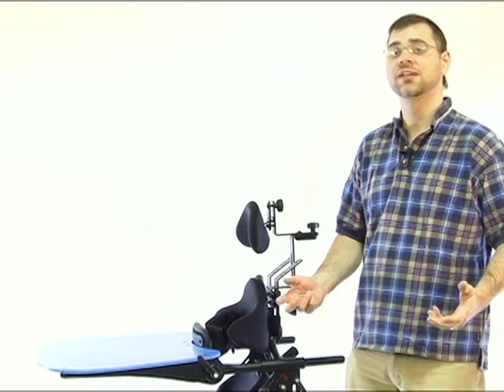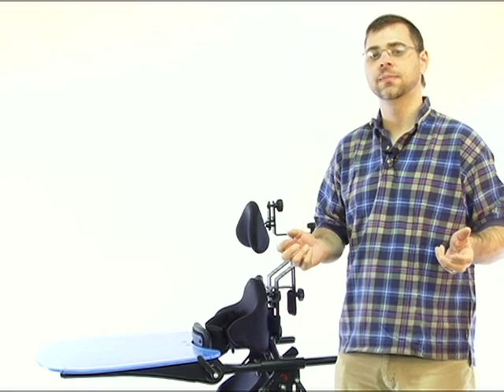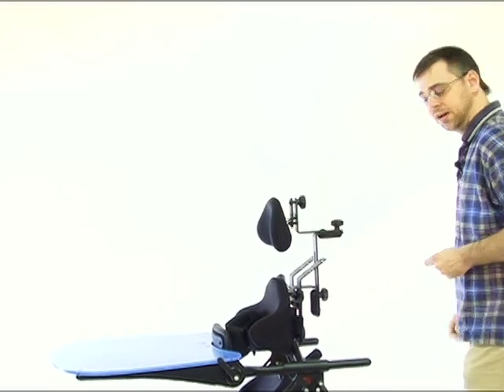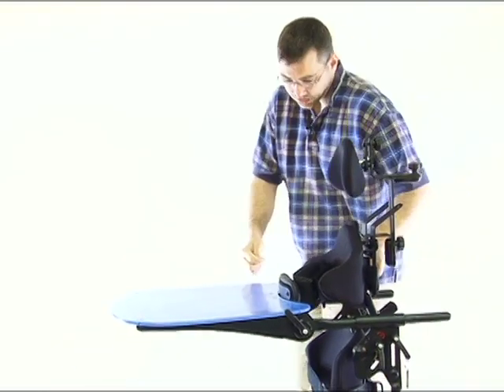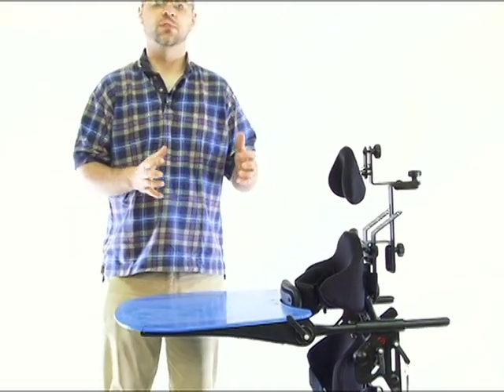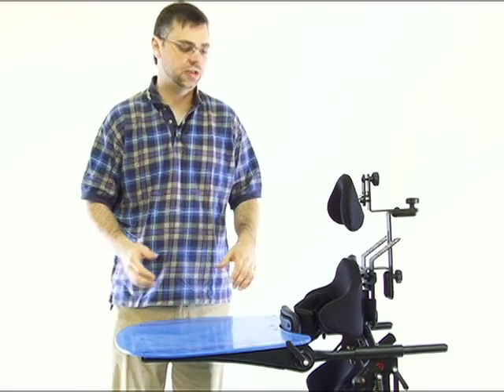Since our original Bantam video, we've made a few adjustments and improvements to the Bantam. I want to take the time to go through and show a few of the key improvements made over the last couple of months. First, the tray — originally adjustable in depth and height, but the two adjustments were tied together. Now we've separated those so you can have individual height adjustment and individual depth adjustment.